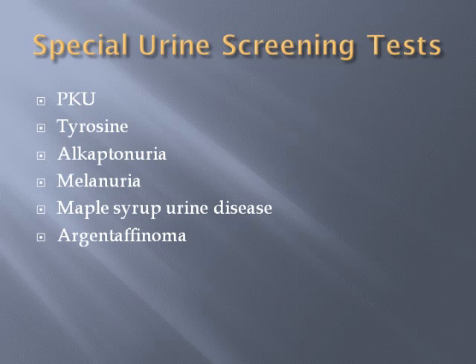Obviously, the presence of phenylalanine in the urine is indicating a metabolic disorder, and if not treated or detected, it can result in severe mental retardation. And so PKU screening tests are done to prevent this, but not every baby goes to the hospital to be born. And so you just might run into a baby or a child who needs to be screened. Their urine needs to be screened for this.